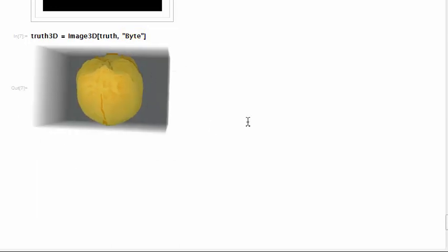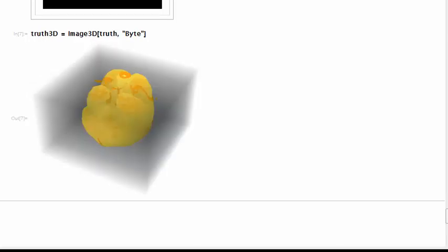Well, here's the output. There's something odd about it, isn't it? Due to the order and alignment of the slices, the brain is upside down. We can correct this using ImageReflect.